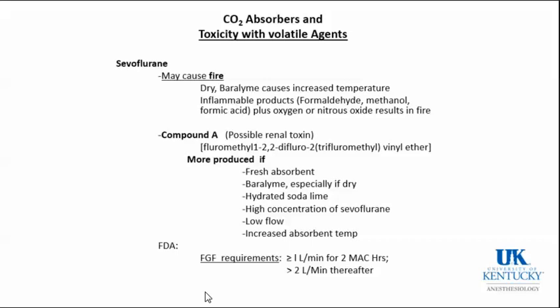And for this reason, the FDA has this fresh gas flow requirement of at least 1 liter for 2 MAC hours, and then after that, you have to have 2 liters per minute fresh gas flow, which is why Sevo was more expensive. However, its basic price has gone down so much that even with these higher flow requirements, it is still cheaper than Desflurane.